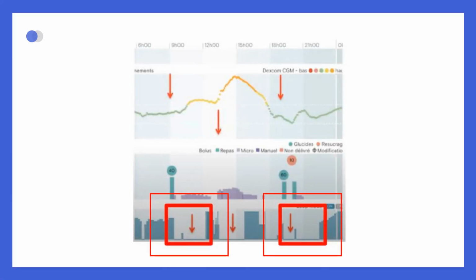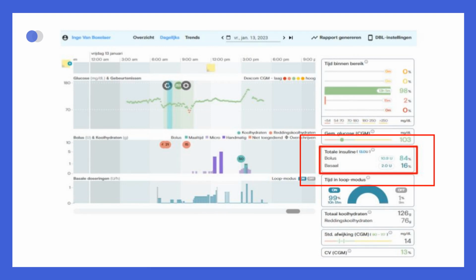After a meal and during autocorrect boluses, the basal insulin level decreases, as per the unique behavior of the DBLG1 algorithm. In the Your Loops reports, the total daily insulin dose is divided into a percentage for basal insulin and a percentage for bolus insulin. The autocorrection boluses are added to the bolus percentage, which means a relatively higher bolus percentage is frequently observed in the reports.